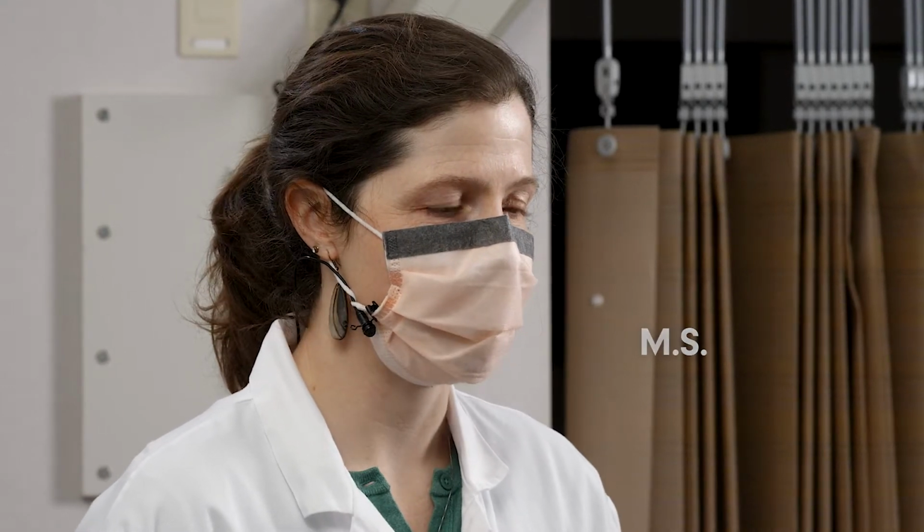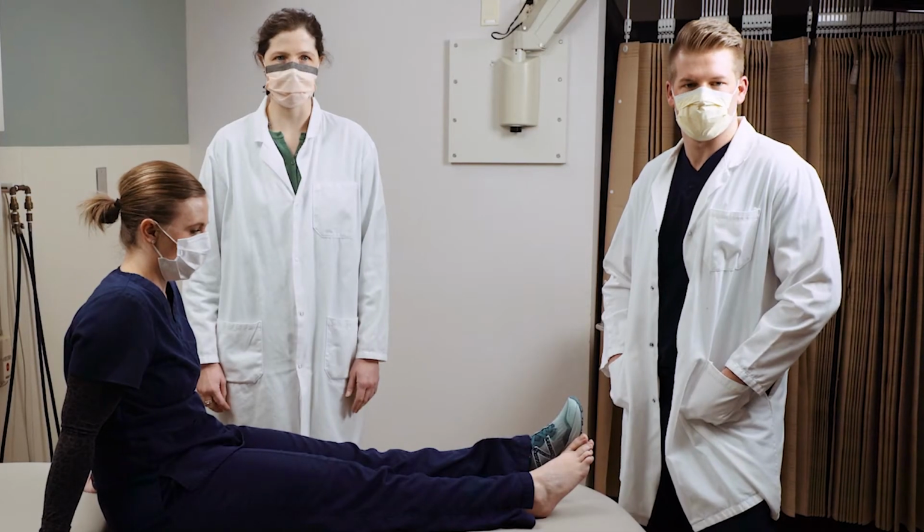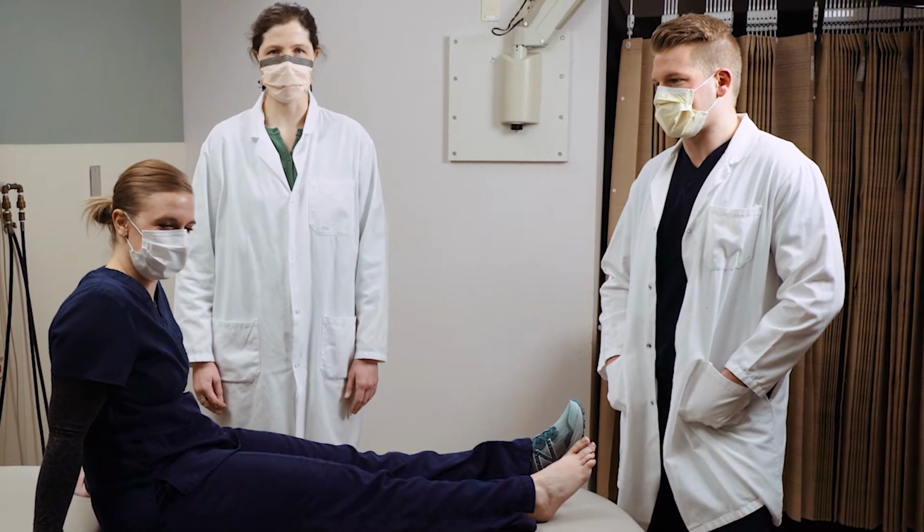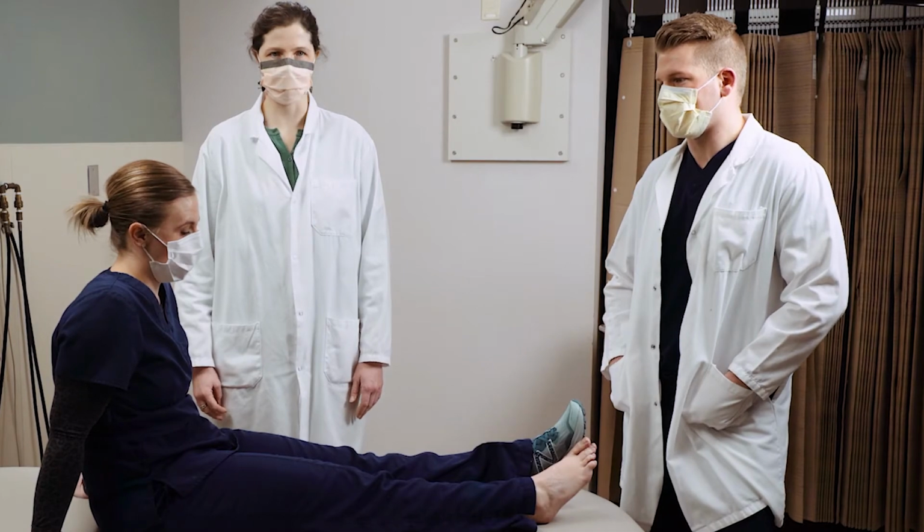My name is Danielle Vlazny. I'm one of the physician assistants with the Gonda Vascular Wound Clinic, and I will be demonstrating a total contact cast on our pretend patient, and then we will also demonstrate several different types of compression therapy.